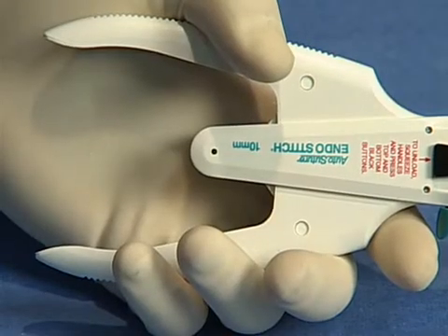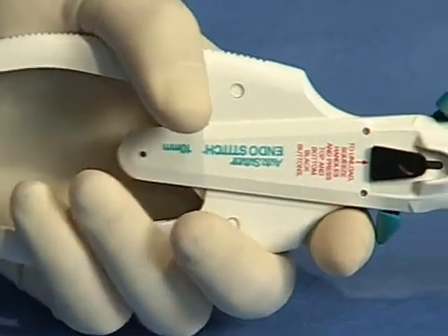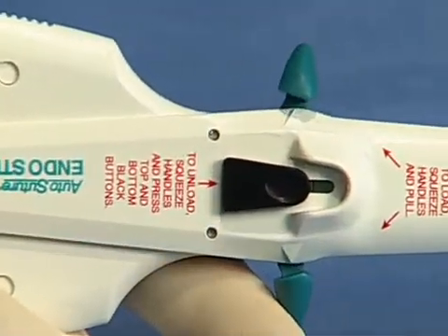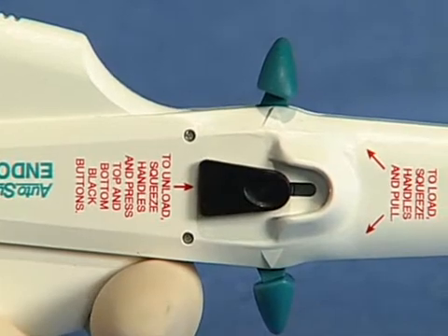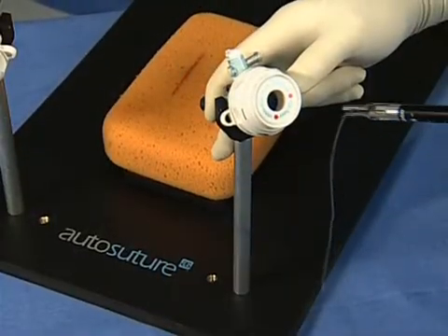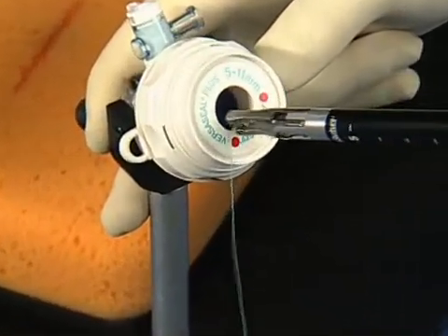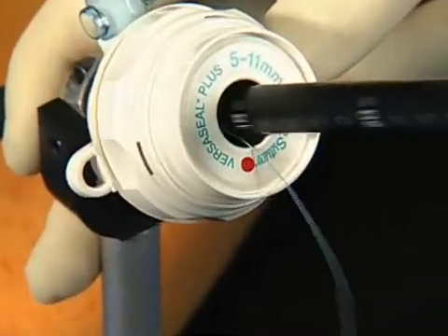To lock the jaws in the closed position, squeeze the handles and push either of the toggle levers until the toggles are parallel and aligned with the molded arrows on the body housing. Note: the EndoStitch suturing device is designed for introduction and use through all appropriately sized trocar sleeves.